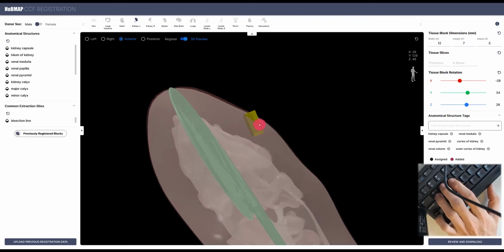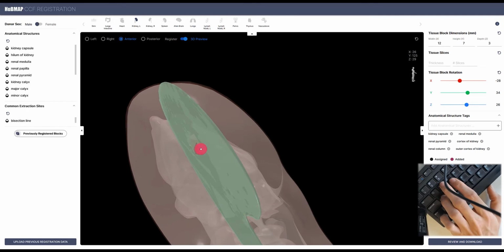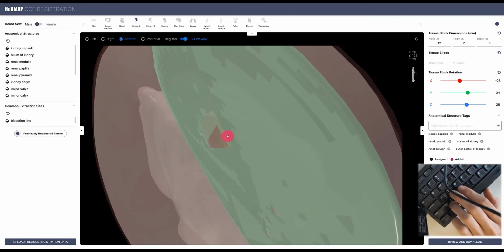So let's actually use that. I'm just going to keep pressing E, maybe a little bit of S to align somewhere around here. So it's kind of like docking a spaceship. All right. So now if I go over to the other side of the bisection line, I can see it start poking through. Let's bring it through a little more. Let's try to refine our alignment here.